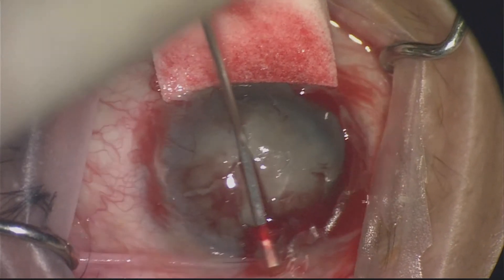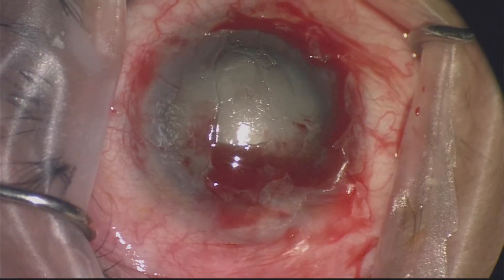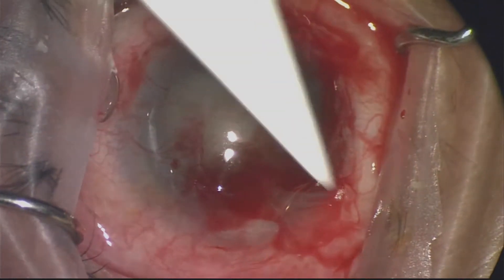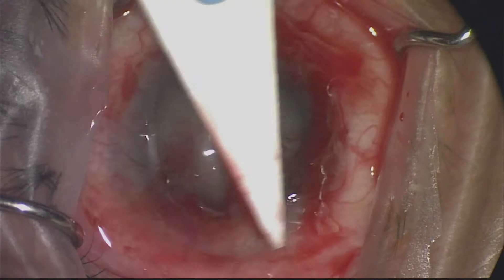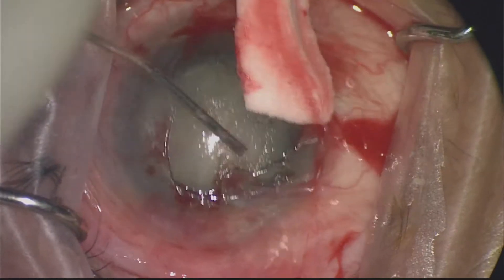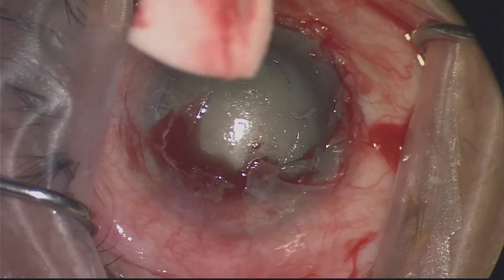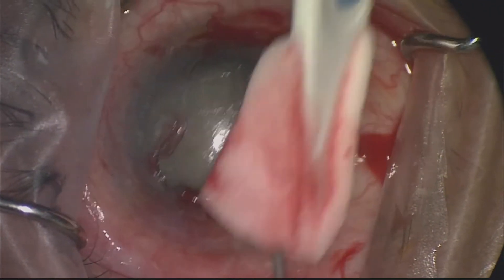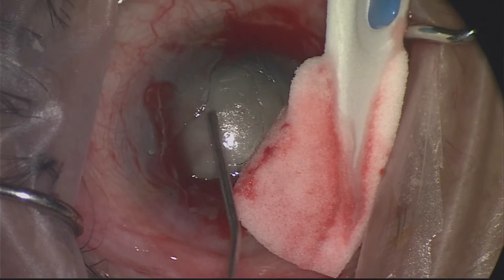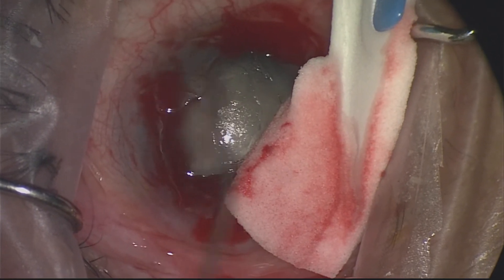When you compare this view now to the one at the beginning, there's a big difference, and this will really help with carrying out cataract surgery in these complex situations. Here I'm just managing the bleeding. You'll get constant oozing — you can use adrenaline drops to calm it down, but ultimately the bleeding will stop itself with time.